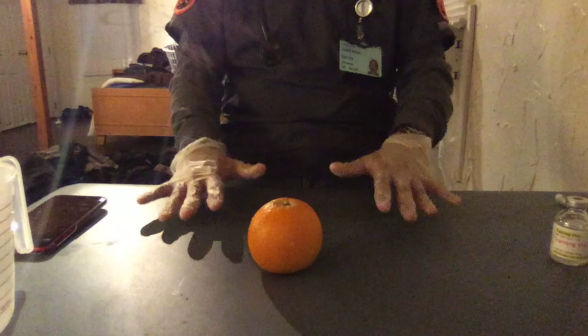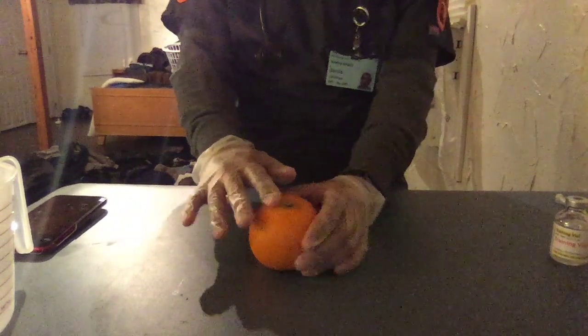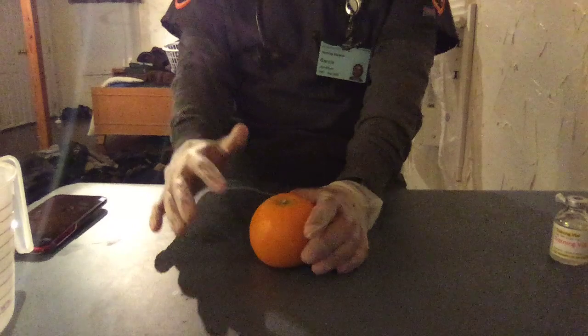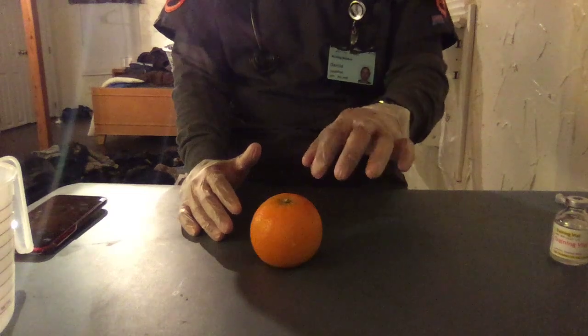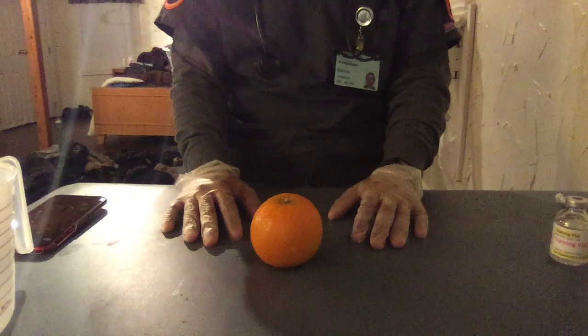I lay her down on her back. Now she's fully laid down. I'll find her umbilical region, and then I will go about 2 inches away from the umbilical. I will also ask her if she's had any other shots around to avoid those places, so I could put a shot in a different place.